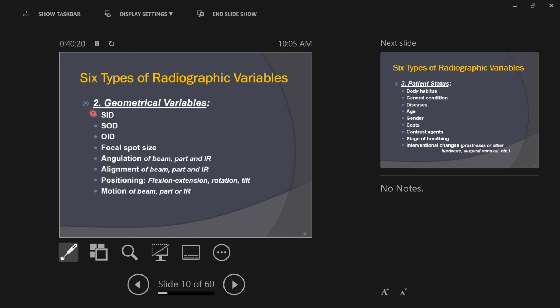I'll say it simply, and so the best way that I've found, besides actually playing with the X-ray machine, the best way that I've thought of to demonstrate these things and practice them for yourselves is to take a flashlight. You have flashlights on your phone, or you can just get a flashlight and play with it. Make shadow puppets, okay? If you have kids, go play with shadow puppets with them, okay? Everything that we could talk about here works with a flashlight, okay?